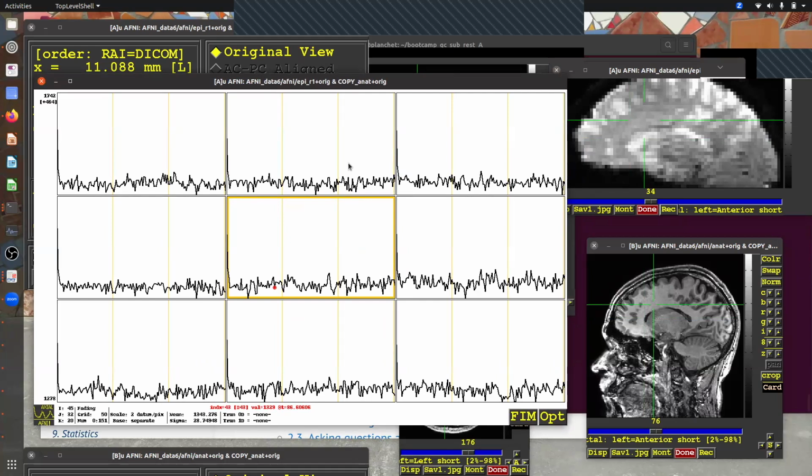What do you see when you look at these time series? And you just think, what are we looking at here? Without knowing too much, how would you describe these things? Does it look well planned? Does it look random? Does it look large? Does it look changing, constant in time? You can think to yourself, it's a little bit hard with people on Zoom and here in person, but these are the kind of properties you might be considering when you're looking at data.